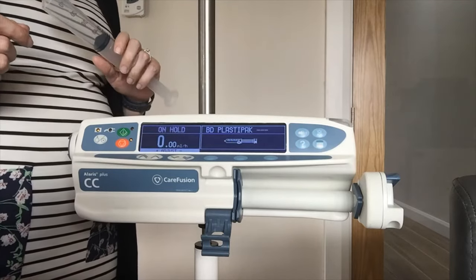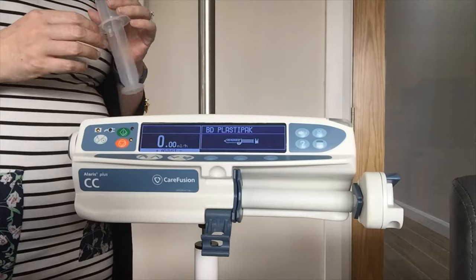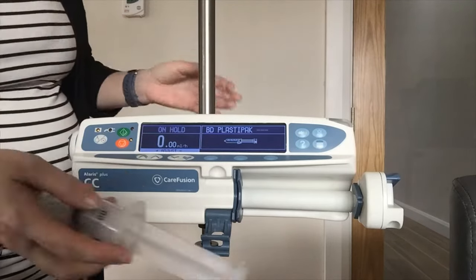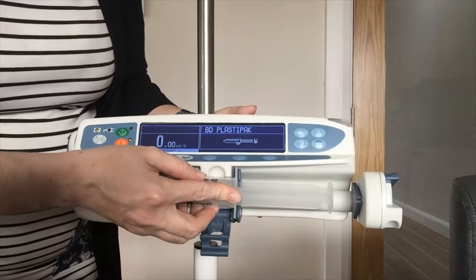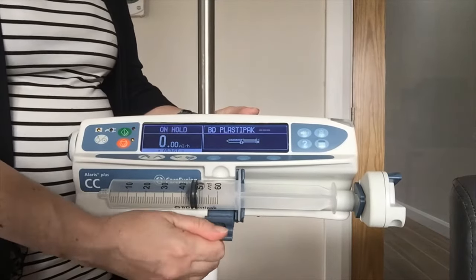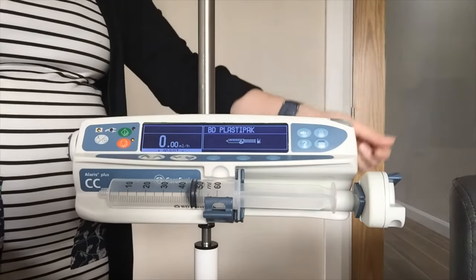The pump will recognise syringes from 5 to 60 ml and it will also recognise your syringe type. I am just going to put the wings of the syringe in between the two pieces of plastic. If it holds itself in position, I am then going to bring the clamp up to hold it and bring in my drive.